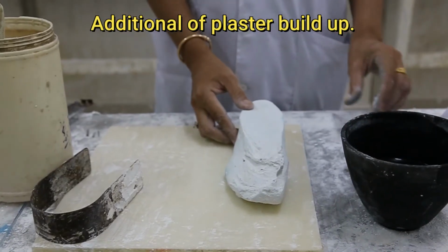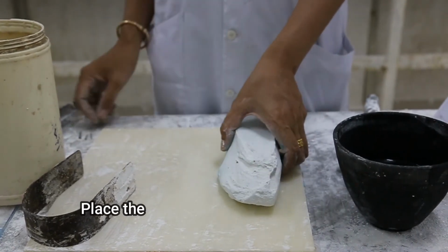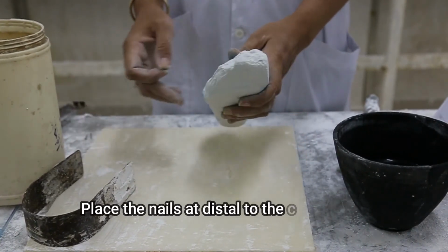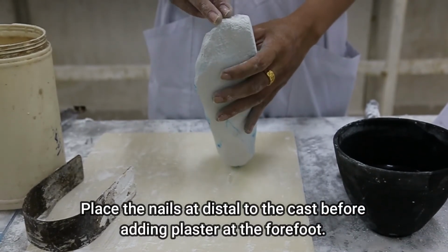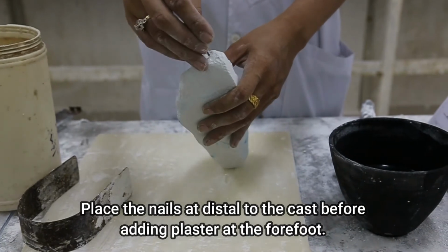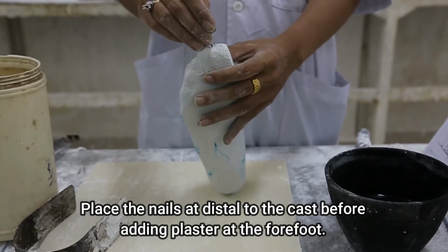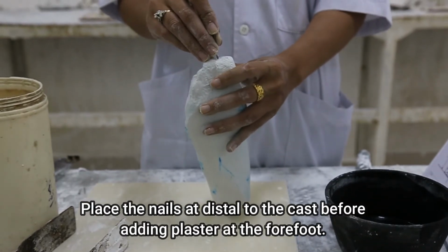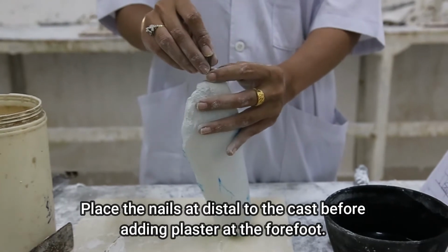So for the next step, we are going to extend the forefoot. Before we extend the forefoot, you need to know how much length you are going to extend. So for me, I'm going to put the nail. When we extend the forefoot, from the foot length, we must extend it by 2 to 3 centimeters. Okay?